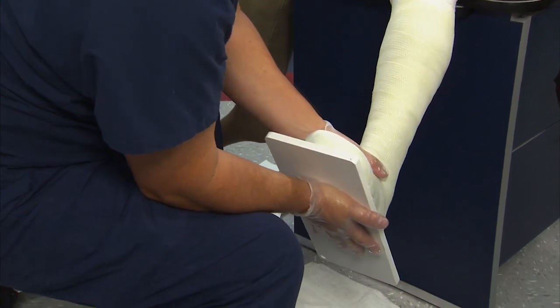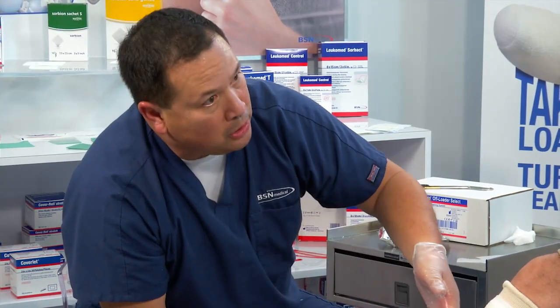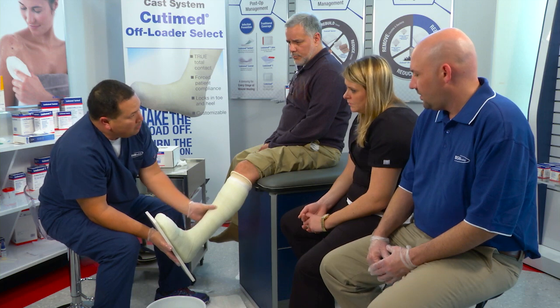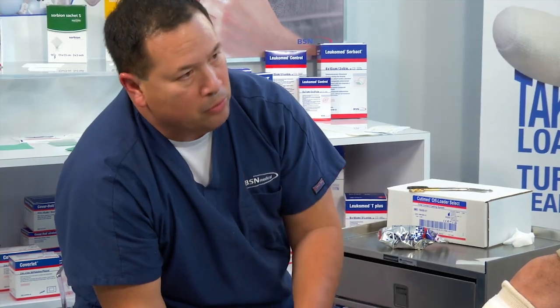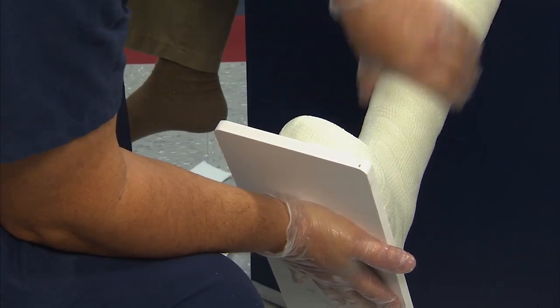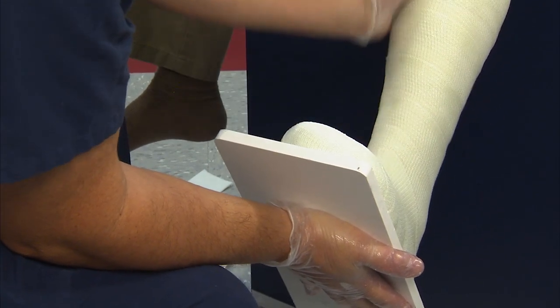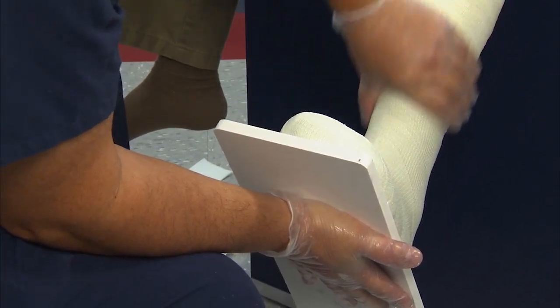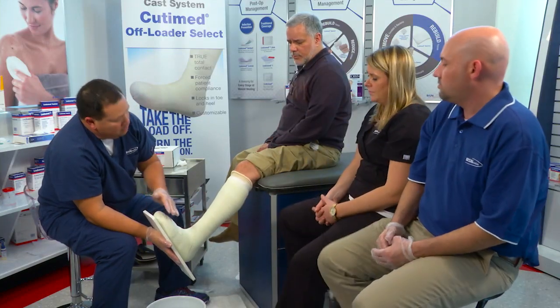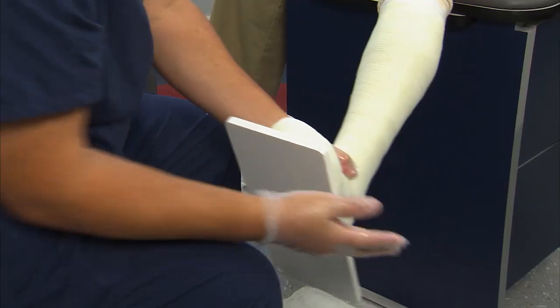As I'm giving that pressure on the bottom, I'm trying to create that flat surface. That flat surface is what's going to redistribute the energy into the cone. The weight of the person determines how many rolls you will use — if a patient weighs 240 pounds or more, I want to use all five rolls. The cast is solidifying right now, and if you had gloves on you would feel the exothermic reaction — that's a natural occurrence between the chemical that helps the cast get hard and dry.